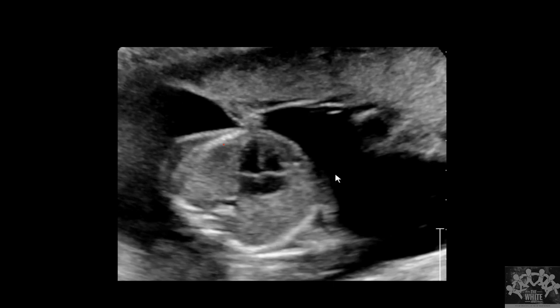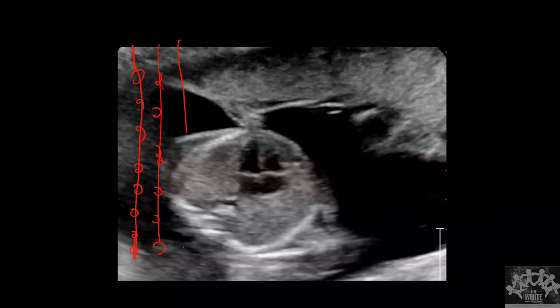Now, one more form of image is the M mode, or the motion mode. It will show how the movement happens. I told you in the previous image how the imaging was done. First we sent ultrasound at this level and found the reflectivity at each point. Then at the second point, we saw the reflectivity, and at the third point as well. That's how we got the B mode.